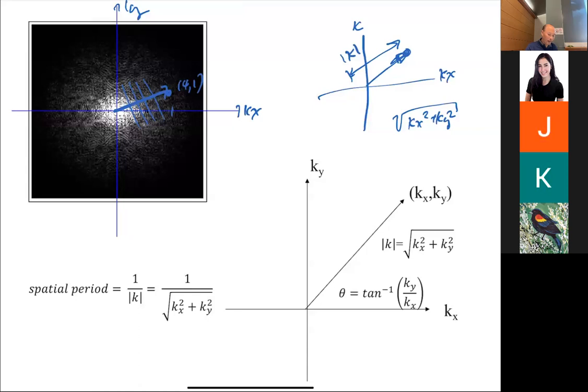Today, the main question is, how do you go through k-space? So today we're going to do spin warp, and that's what we started last time. Spin warp is where you go line by line by line, okay? Now, in your homework, not in your project, you're actually going to do something different. You're going to go through k-space like a square spiral, okay? Although you could do that as a project too. You could look at different ways of going through k-space.